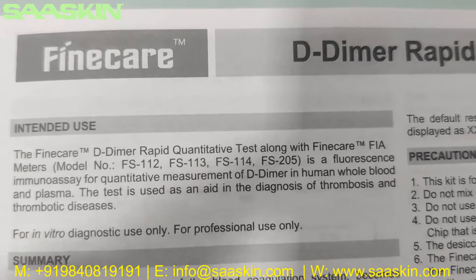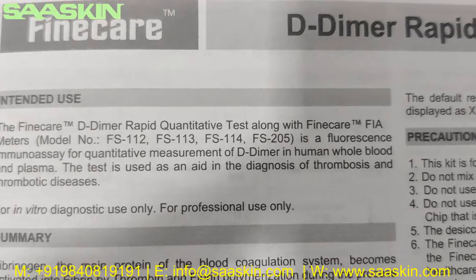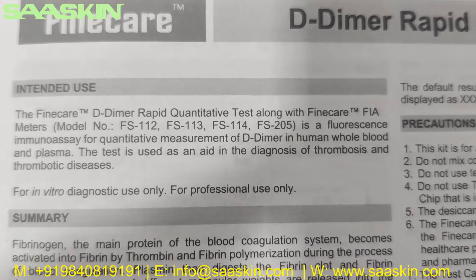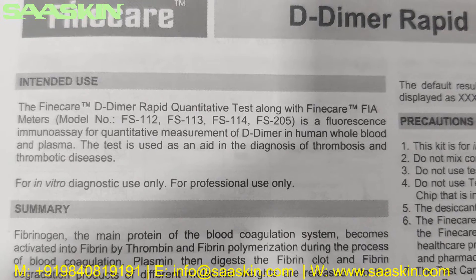The IFU states that the FineCare D-Dimer Rapid Quantitative Test, along with the FineCare FIA meters, is a fluorescence immunoassay for quantitative measurement of D-Dimer in human whole blood and plasma. The test is used as an aid in the diagnosis of thrombosis and thrombotic diseases.